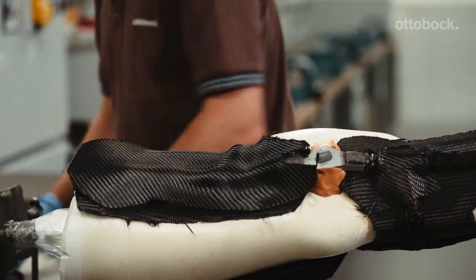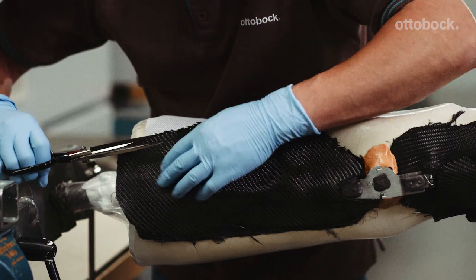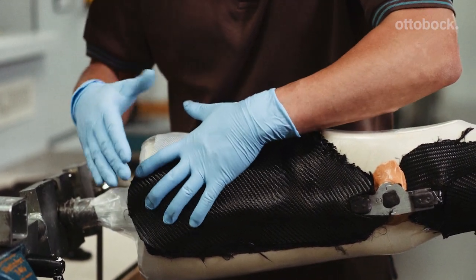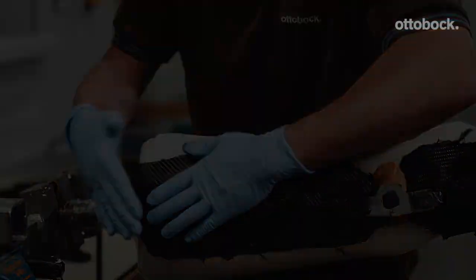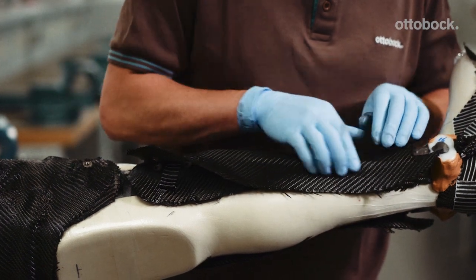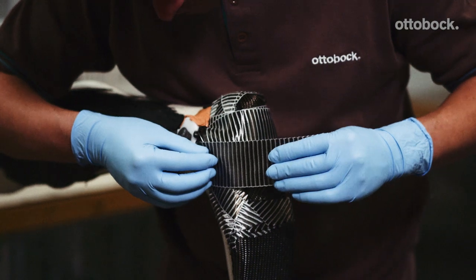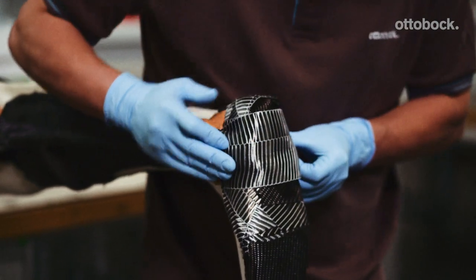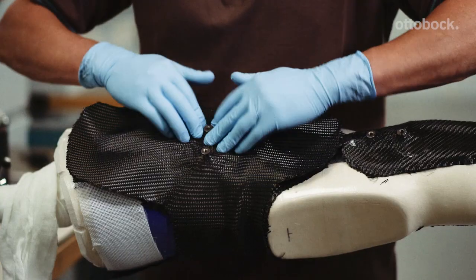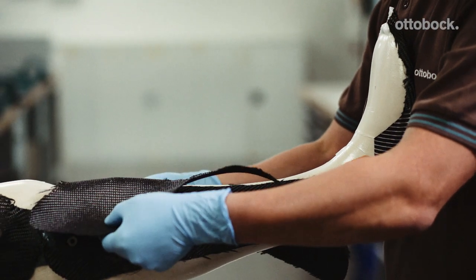Two layers of carbon fabric with a 90 degree fiber orientation are now applied to the thigh area, and two layers to the lower leg area. Two strips of UD carbon are now applied to the foot component horizontally over the foot stirrup from medial to lateral. This is followed by two more complete layers of carbon fabric, this time with a 45 degree fiber direction on the thigh area and two complete layers on the lower leg area.